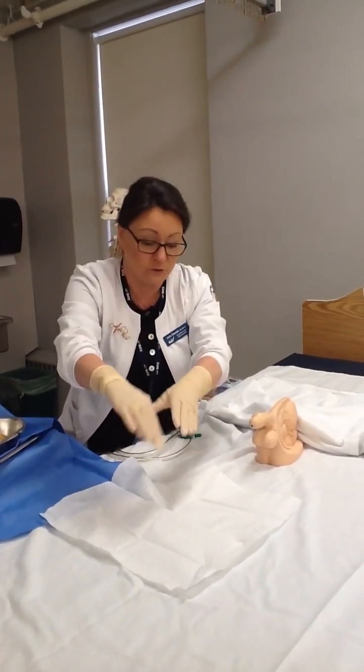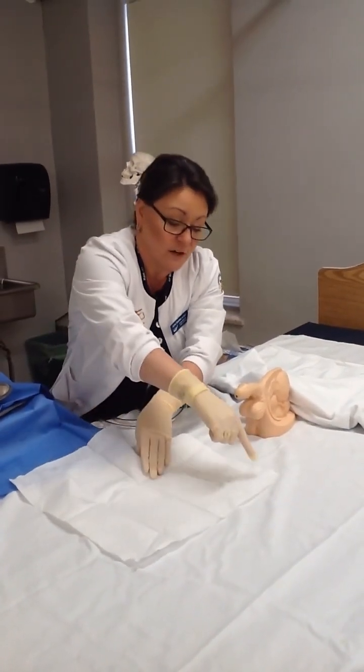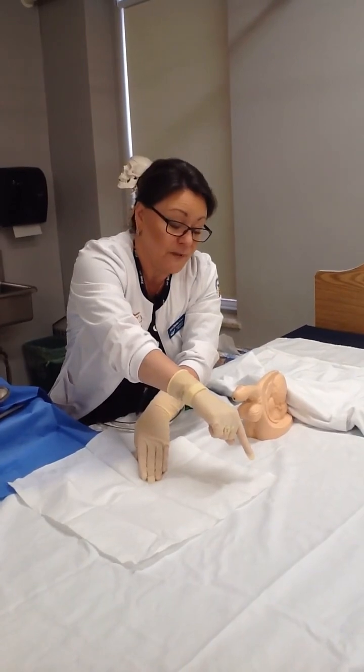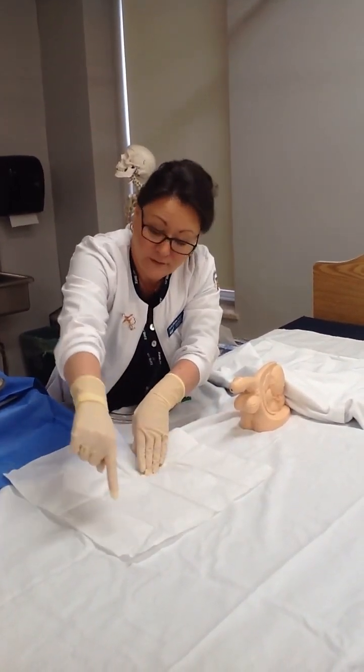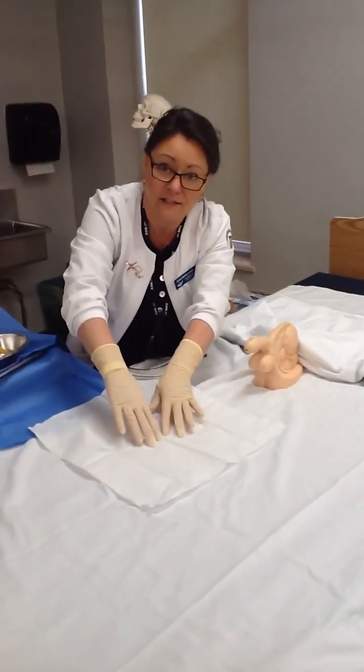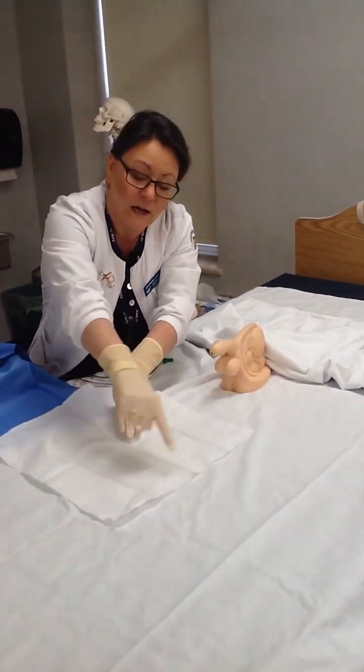If you look again at this sterile field and what I've told you about the principles, there is a 2.5 centimeter, or 1 inch, unsterile border all along the outside of this drape. So I can touch in there. That's sterile. Sterile can touch sterile. But I don't want to get near this unsterile border.